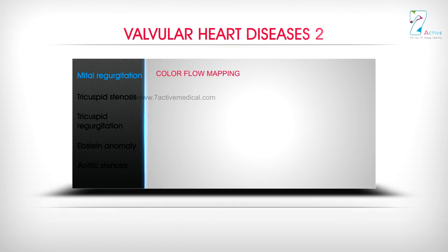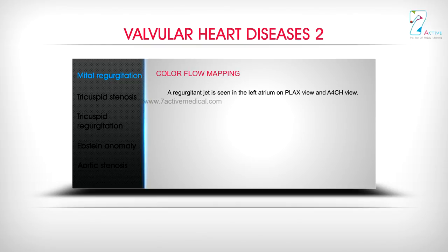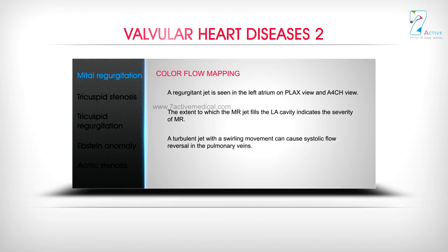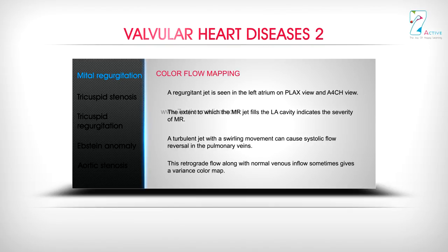Colour Flow Mapping: A regurgitant jet is seen in the left atrium on PLAX view and A4CH view. The extent to which the MR jet fills the LA cavity indicates the severity of MR. A turbulent jet with a swirling movement can cause systolic flow reversal in the pulmonary veins. This retrograde flow along with normal venous inflow sometimes gives a variance color map.